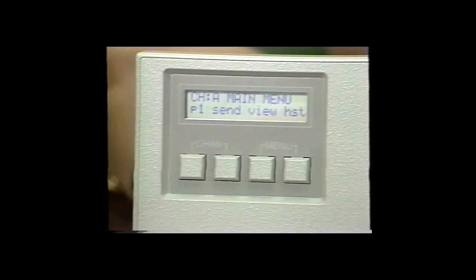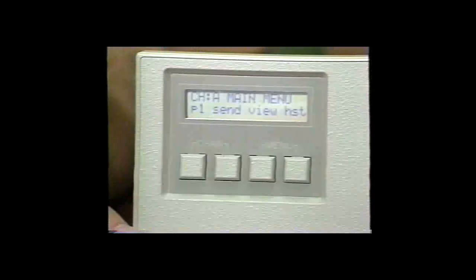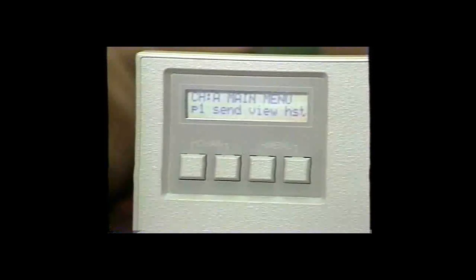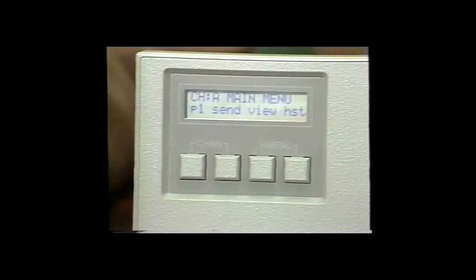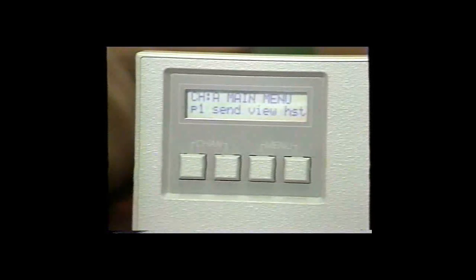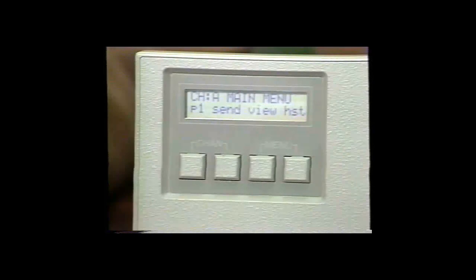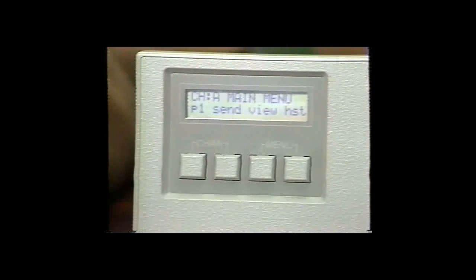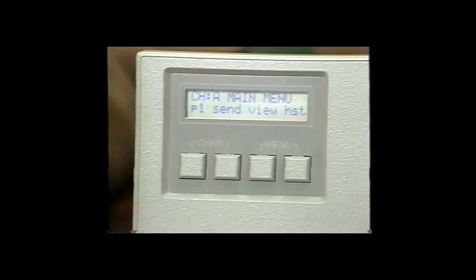The Send function is used to send the last strip to the information port. This will be used to communicate with a printer or a computer to generate the information read into the densitometer. View is used to view the strip just read into the database. History is used to access the database where that strip was stored, as well as other strips stored in the individual database.